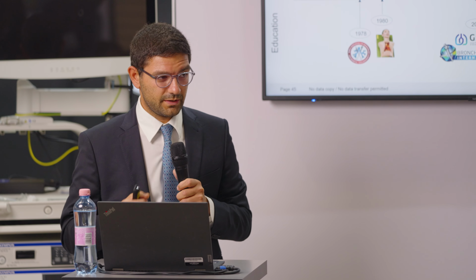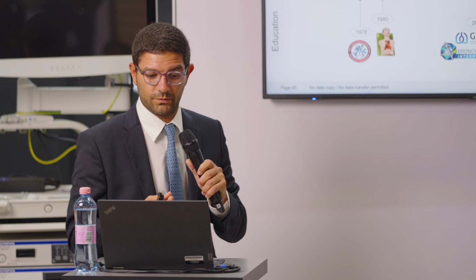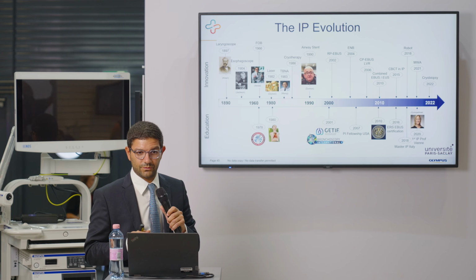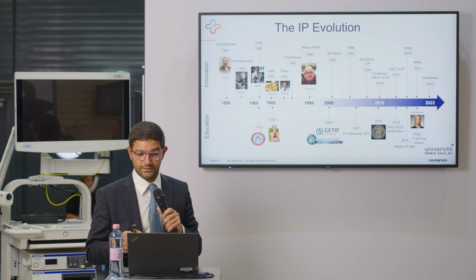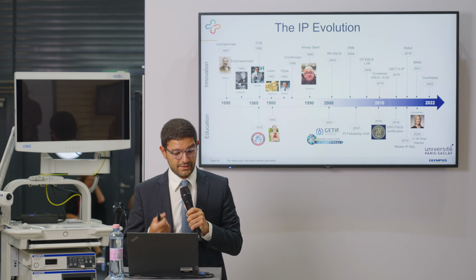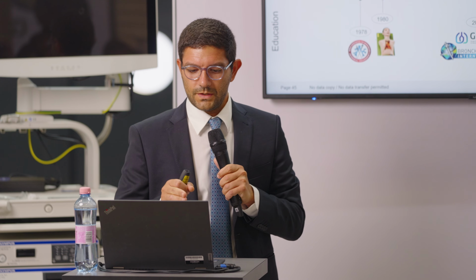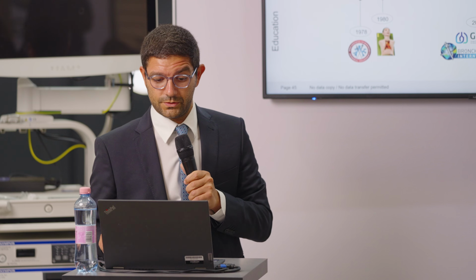If we look at the history of interventional pulmonology, we started with simple instruments used by Killian in the 1890s, who was the first to visualize the airways, and he was able to remove a foreign body from the trachea. Following his experience, Jackson Chevalier, an American ENT, had the same experience. In the 1960s, with the development of fiber optics, Ikeda developed the fiber optic bronchoscopy.